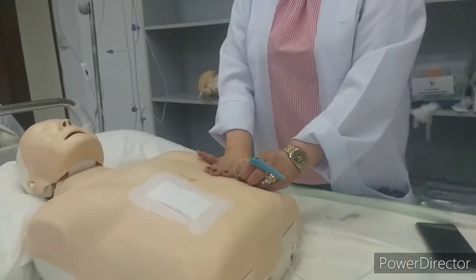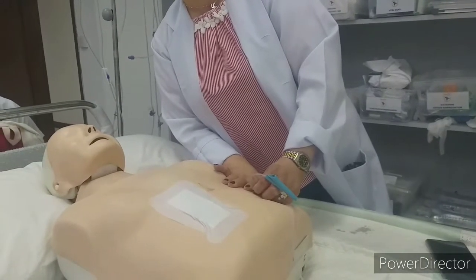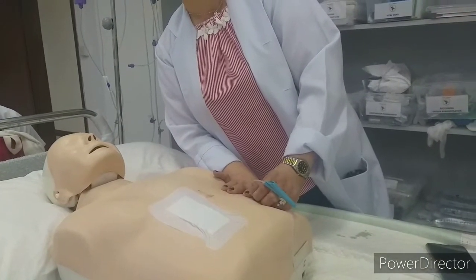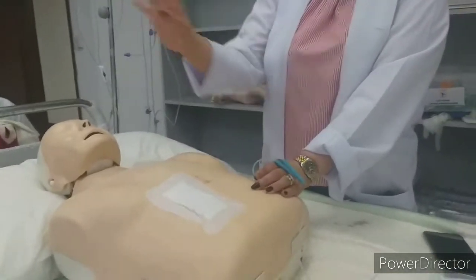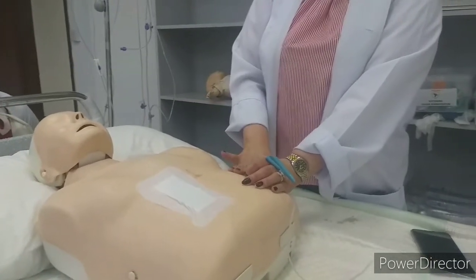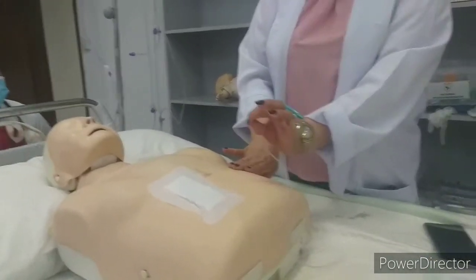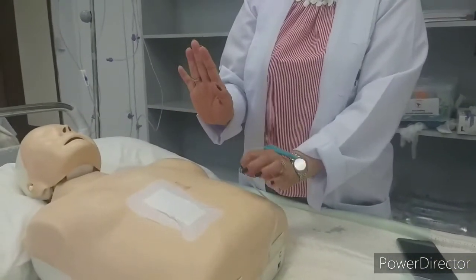Same. Are we also going to use the dressing towel? The dressing towel, no need to use. There is nothing. Only for your cotton balls. Okay? Cotton balls, dry gauze. That's all. There is no patch. There is no adhesive. Ma'am, only one circular motion.